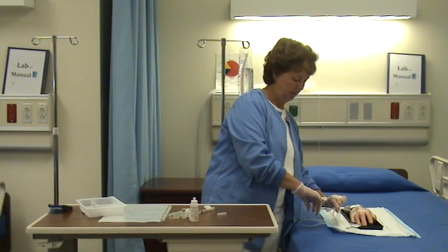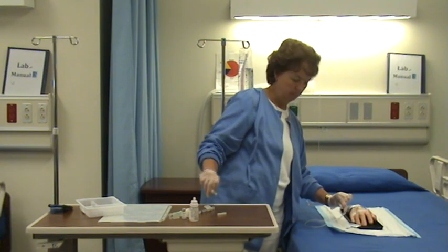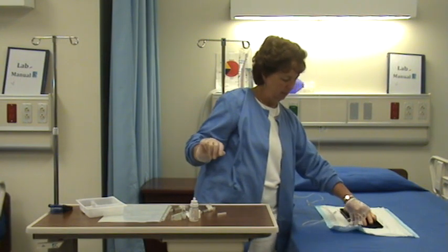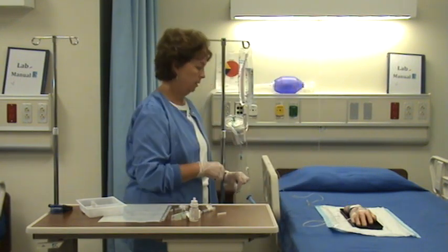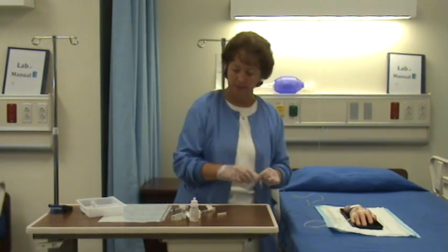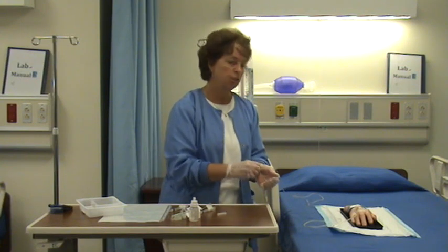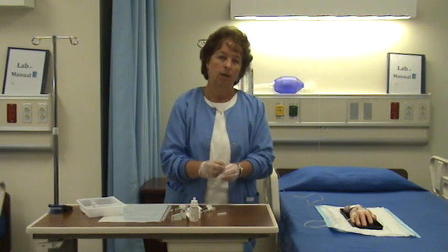I gave that about the same rate. And now, it looks like it's pretty flushed out. I'm just going to slowly administer the rest of my saline. And then that would go into sharps. And then I'm just going to make sure the IV is regulated at the rate that it's supposed to be. And that's it for giving an IV push medication via a running IV site.